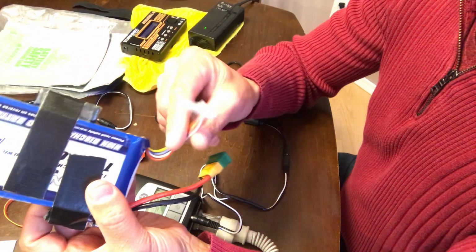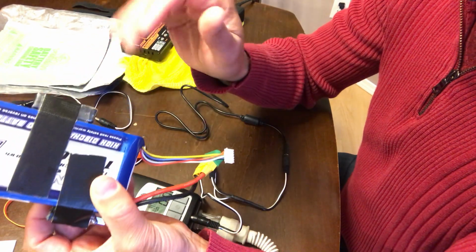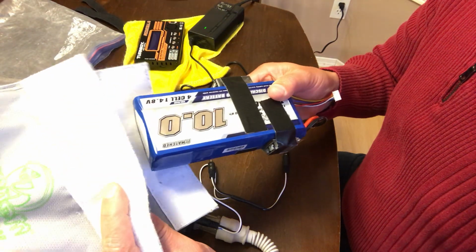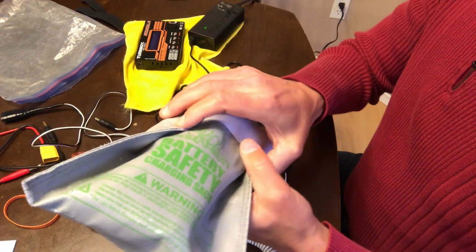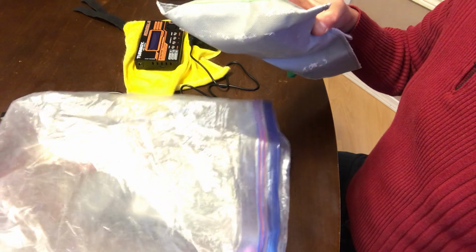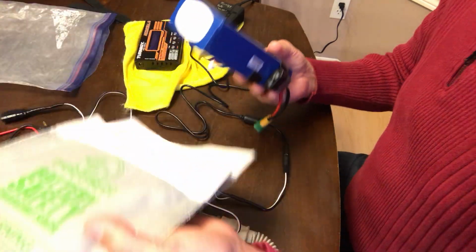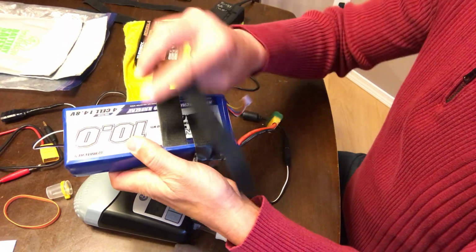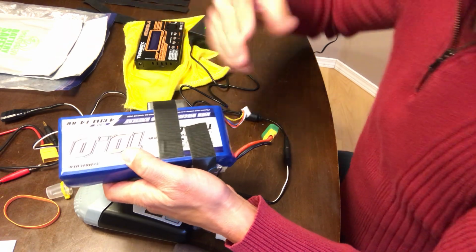So these little wires are fantastic because not only do they give you feedback of the battery health, you can use them to charge and to let you know when things are running low. And of course, they say when you charge these, you always want to put them in a fire bag. So I constantly had this thing in a fire bag, and then I would put that inside of a Ziploc baggie to keep it dry in case I got dunked in the water or something. So I was trying really hard to keep the water off of this when you're backpacking. And I would use a strap, and I would wrap it tight over the top of that just to keep everything tight. I used 3 straps that were all the same length for various purposes.